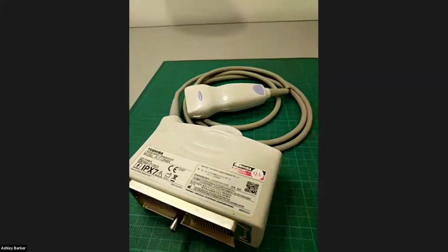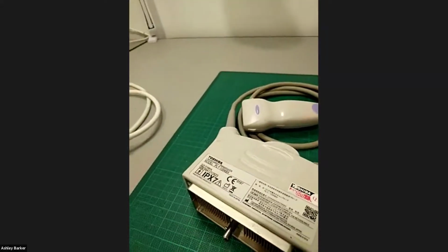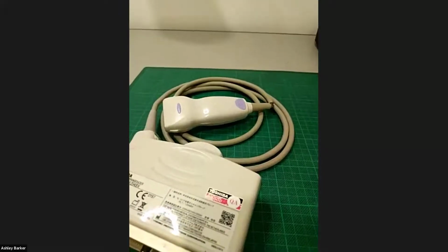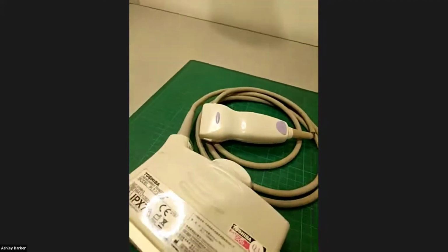Alcohol's always been bad. There's been a few products come out over the years. There was one that was just called ultrasound cleaning solution or something in a little spray bottle, and it was literally isopropanol in a spray bottle, labeled ultrasound cleaning solution. Yeah, I remember that. I bought a box of 12 of them, and I reckon they're probably 7 or 8 years old now, and I'm still going through them. It's great for hand sanitizer at the moment.